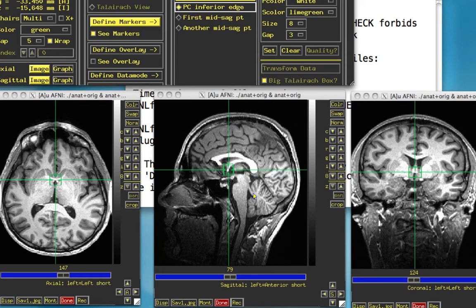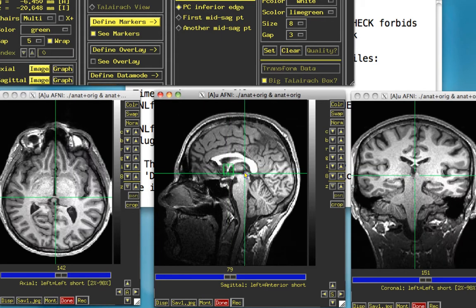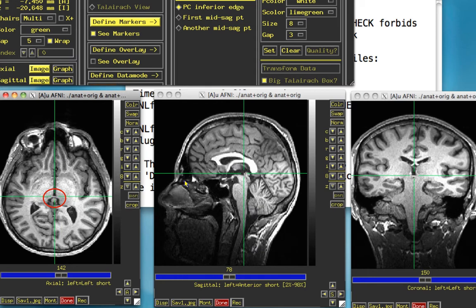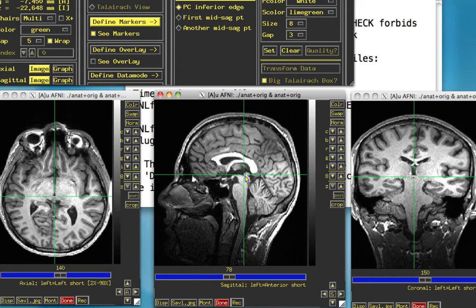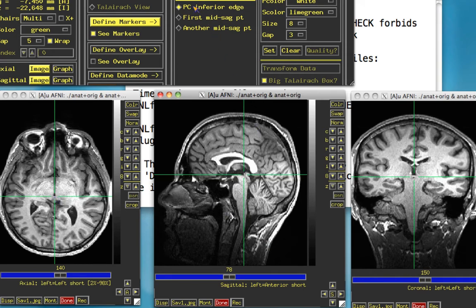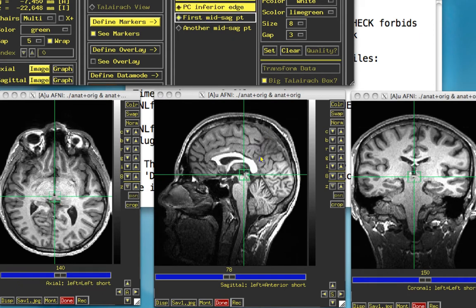For the posterior commissure, this is a slightly trickier landmark to find. A good rule of thumb is it's at the very top of the cerebral aqueduct. You can see there's a thin band of white matter right about here. If your anatomical data set isn't very high resolution, it can be very hard to see. Move around until the posterior commissure — this bundle of fibers connecting the two hemispheres — starts to come into view. Click Set. Now we need two mid-sagittal points.